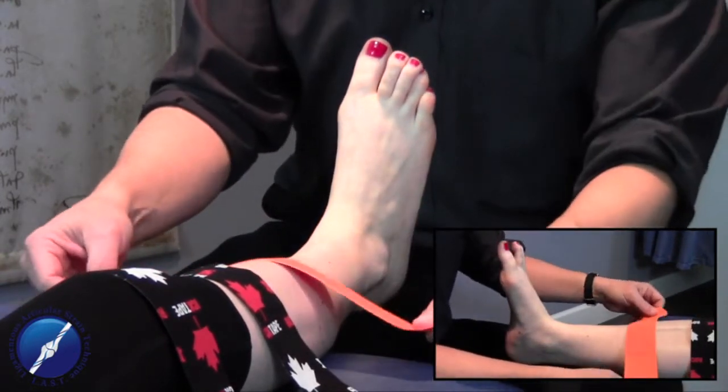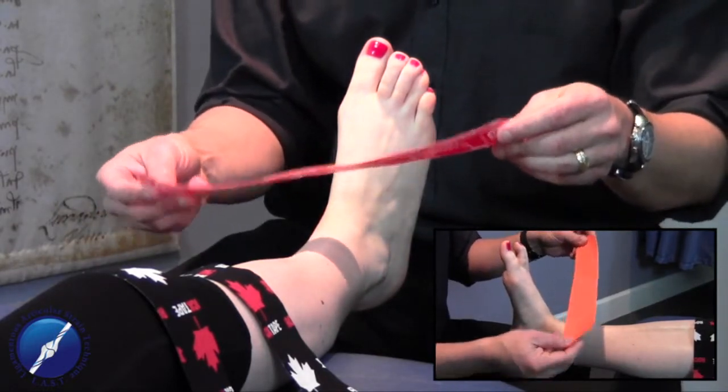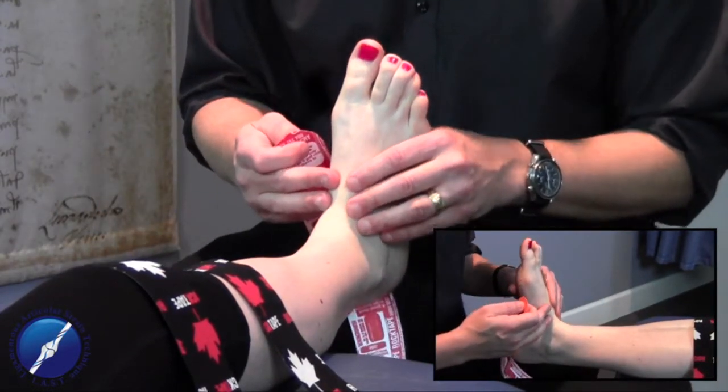I've got some pre-cut, pre-measured tape that I'm using. This is the rock tape. We tape for pain, posture, and performance.